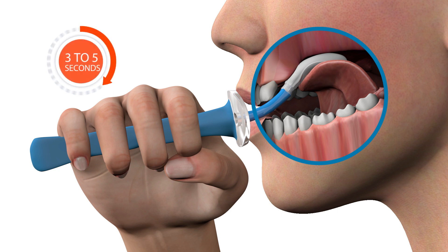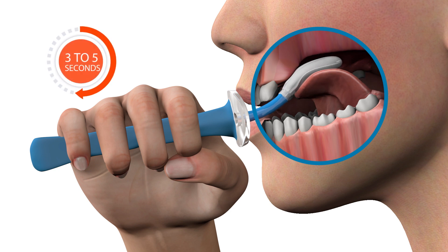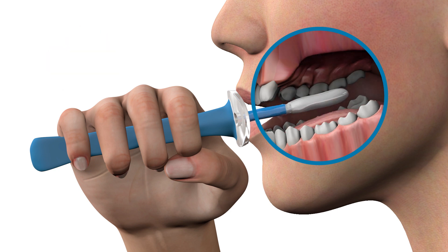Hold the bulb there for three to five seconds before relaxing your tongue to a comfortable resting position. This exercise should be repeated four more times.